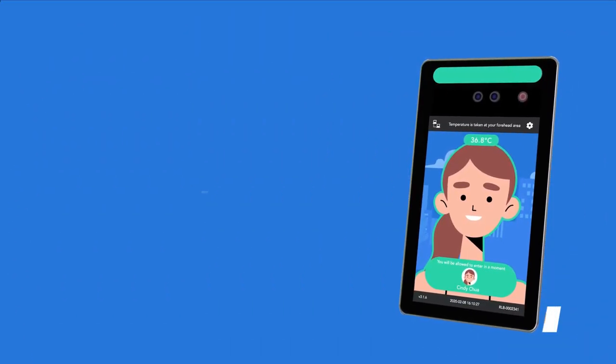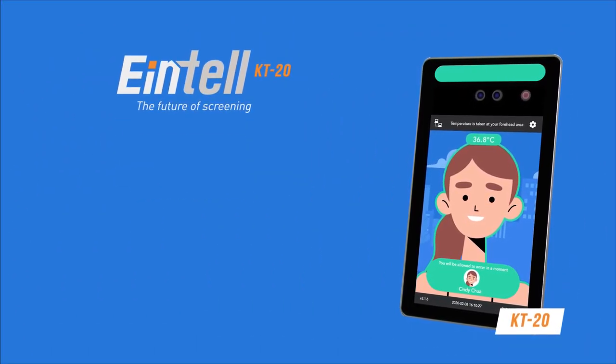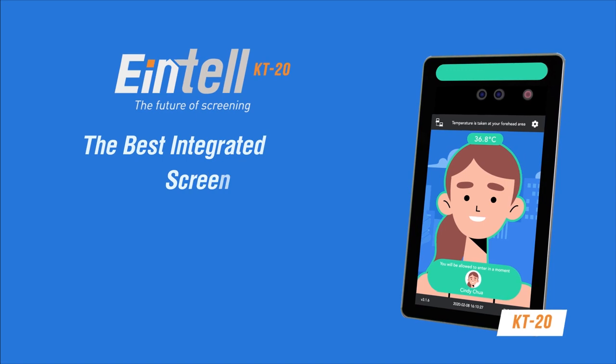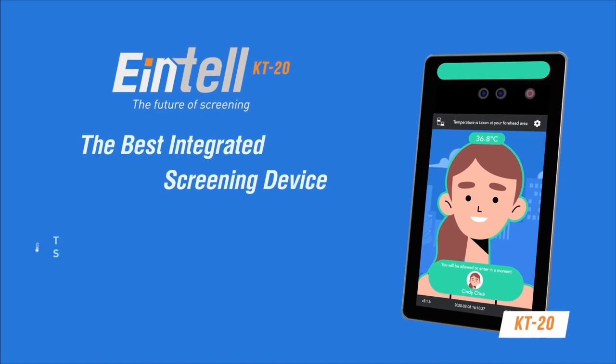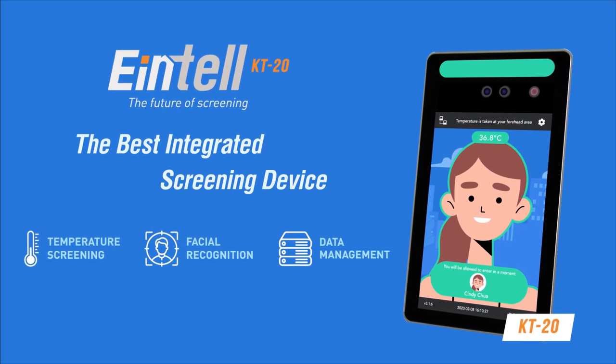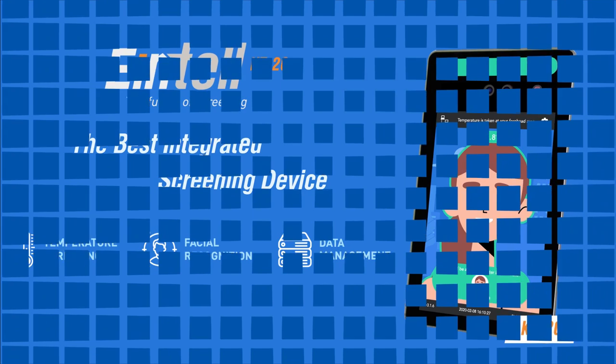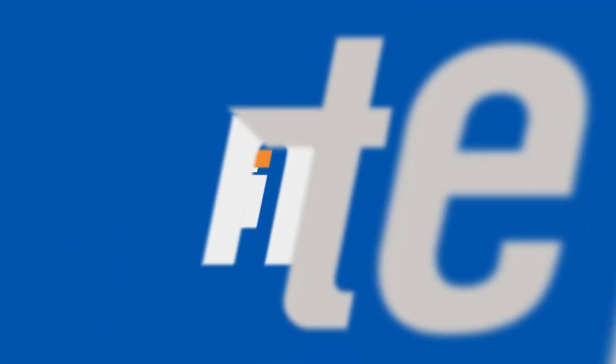With the features packaged into an easily deployed user-friendly device, the KT20 is the solution of choice. Get your Eintell today!